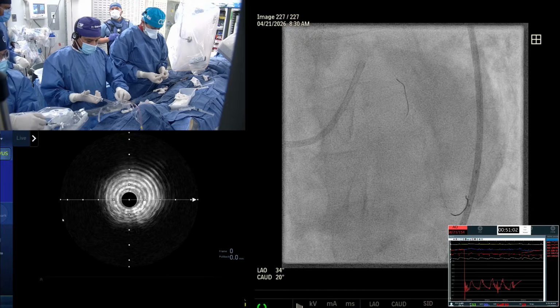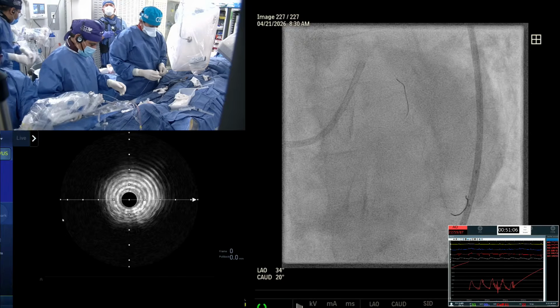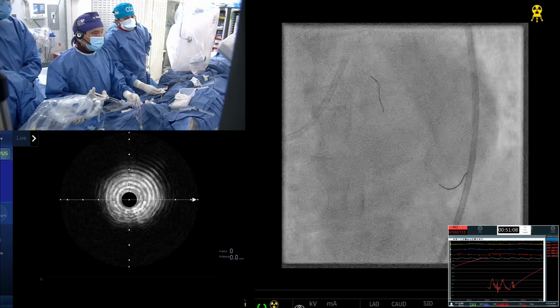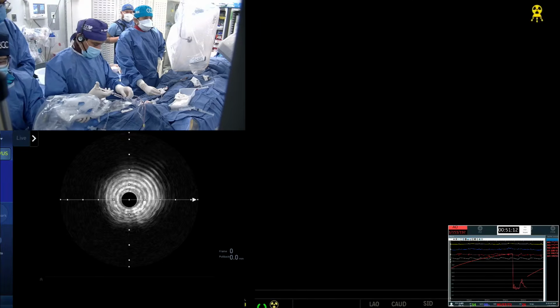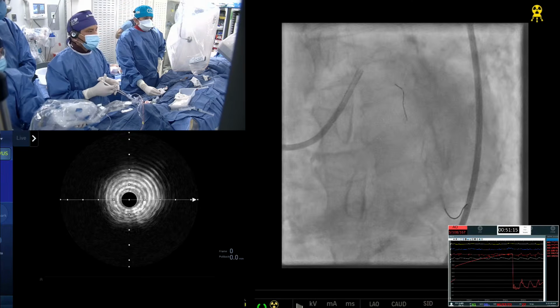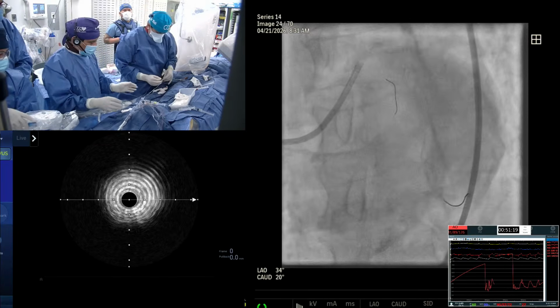Verapamil. I mean, the proximal ostial circumflex, is it angulation or lesion? No, there is a lesion and a lot of calcium. Calcification, yeah, but not severe, moderate calcium. Let's see. Have a 3.5 and a 4. IVL ready. Maintained. So good.